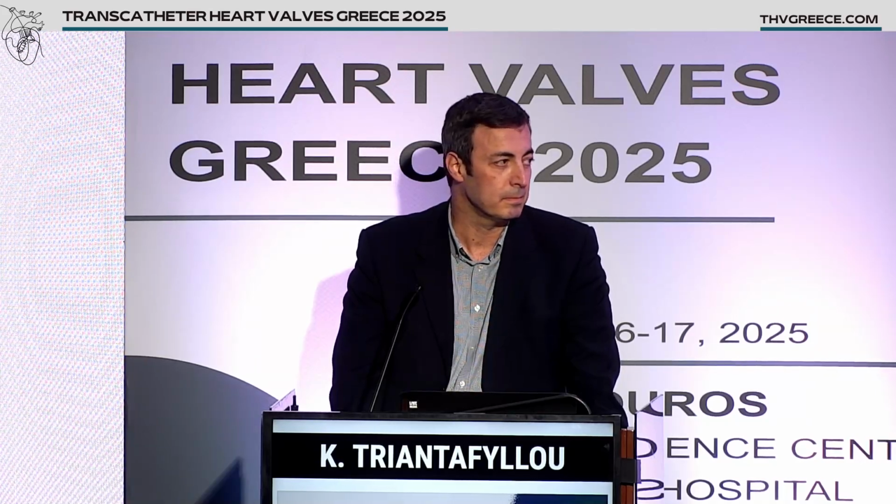A comment? I would like to thank Dr. Sparigas for his kind invitation, and I would like to congratulate Kostas for his great talk, which highlighted the ways to overcome the main limitations of valve-in-valve TAVI, which are PPM and coronary artery obstruction. He chose the proper valve system, a self-expanding valve with supraannular position of the leaflets. He performed aggressive post-dilation in order to remodel the surgical valve, and he protected the left coronary artery by performing chimney stenting. I have a short question, Kostas, about the antithrombotic therapy in these patients. What is your strategy? Do you see any role for oral anticoagulation?